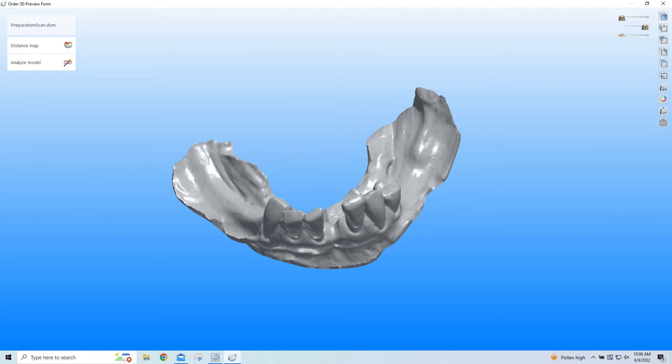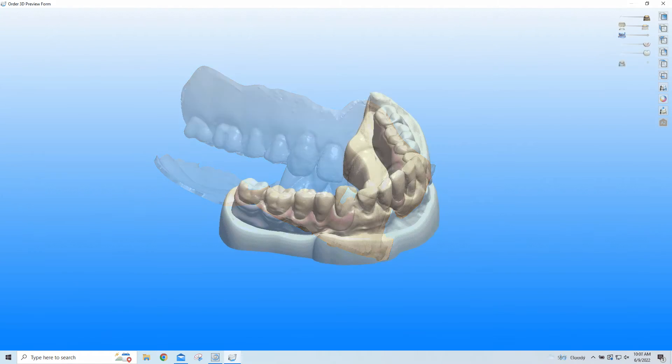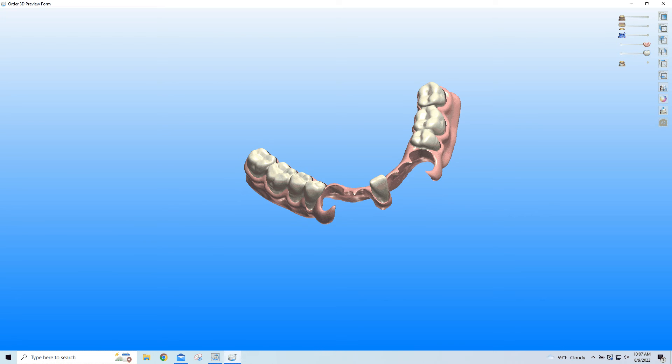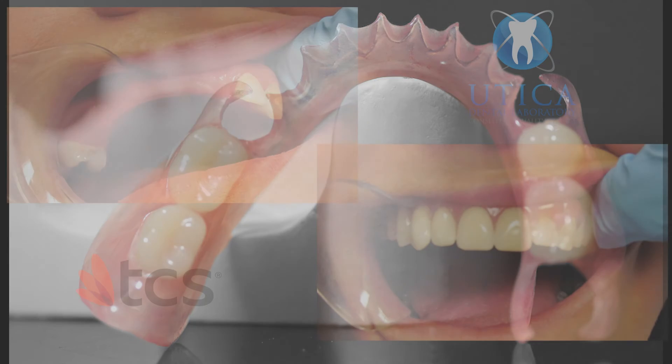First, your patient's impressions are scanned and the framework is CAD-CAM designed before the material is milled via our PROGRAMIL PM7 from Ivoclar. Teeth are CAD-CAM designed and printed with Digital Dental Teeth Resin by Kulzer. Then, the teeth are fused to the denture base with a specific nylon bonding agent.